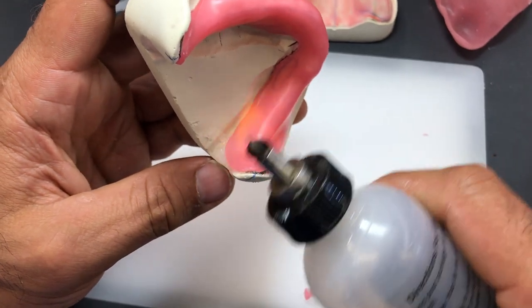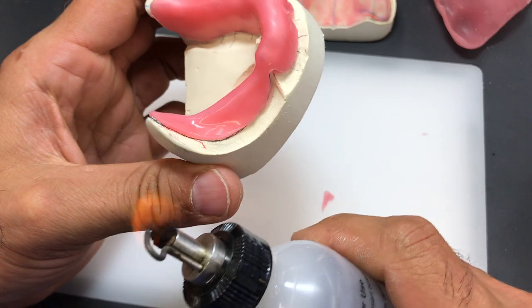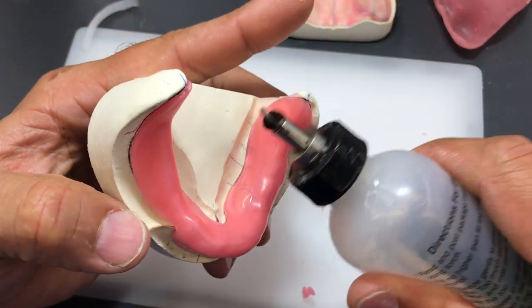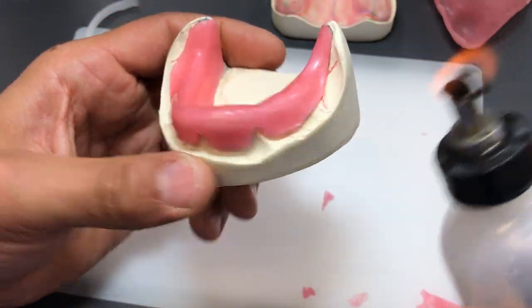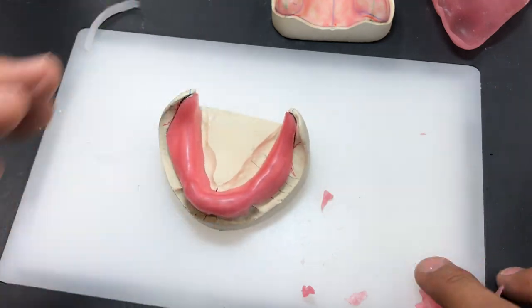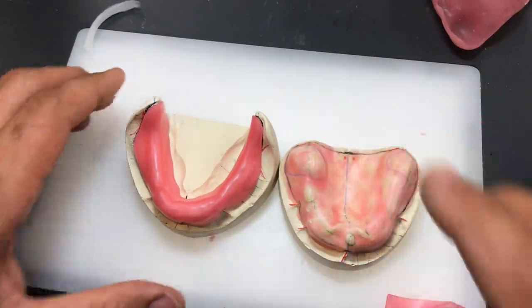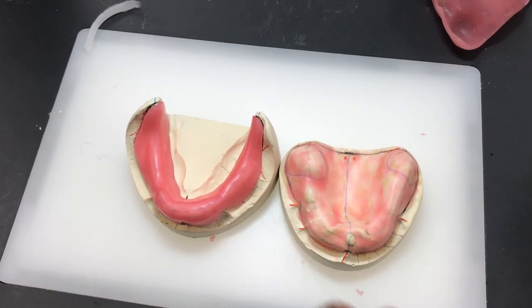So I'm going to give it a gentle flame here with my alcohol torch. And that is the wax spacer versus the thin layer of wax that we introduced on the upper.